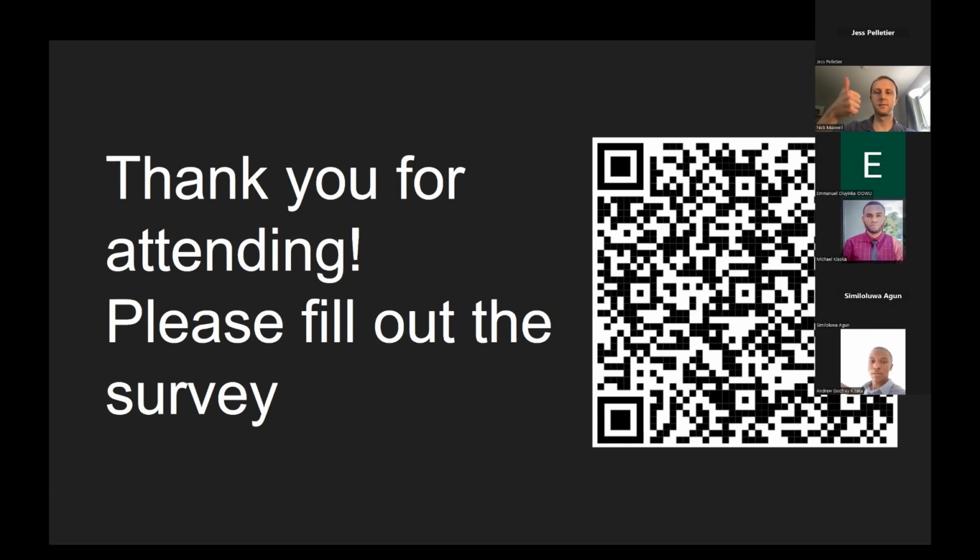Okay, perfect. So to go through question 1, which condition is not typically listed as an indication for pacemaker implantation? The answer here would be sustained ventricular tachycardia not amenable to other treatments. If someone's having recurrent ventricular tachycardia, they really need to have a defibrillator implanted, so an AICD, rather than just a pacemaker. I suppose you could do overdrive pacing, but typically sustained ventricular tachycardia is not an indication for a pacemaker alone. You'd need a combined device that can defibrillate and pace.